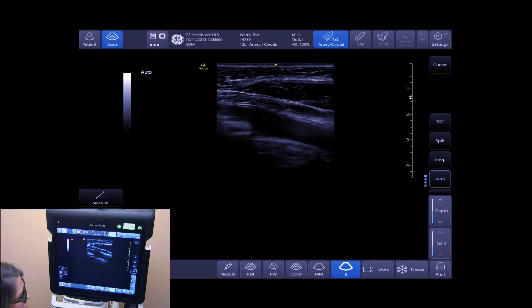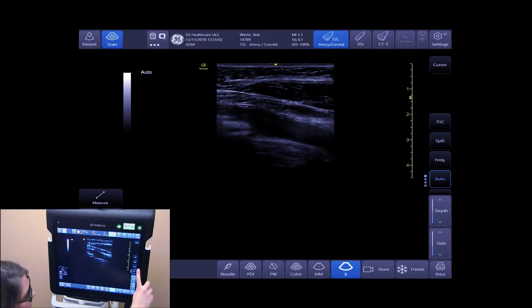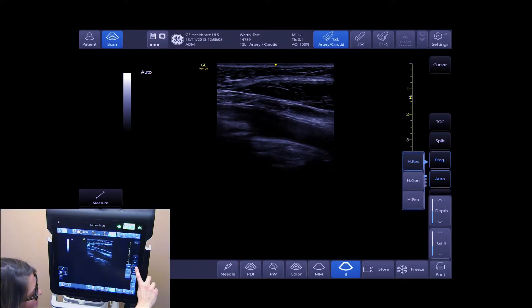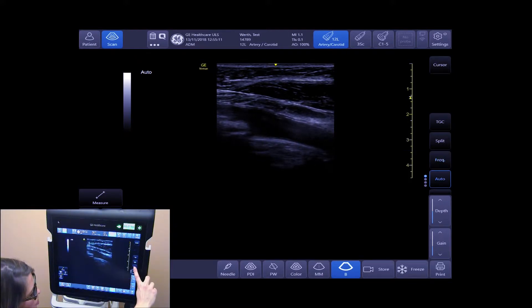To adjust your frequency, tap on frequency on the right-hand side of your touch screen. This will give you the options of H-Res, Gen, and Penetration.